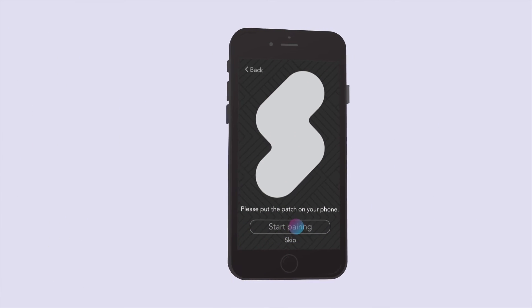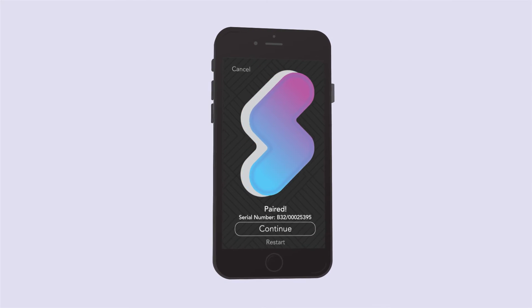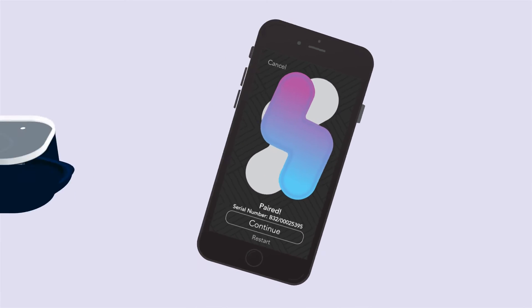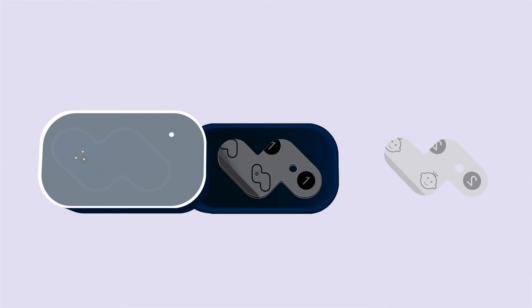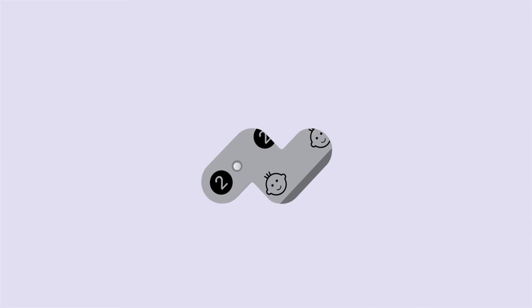Next, follow the on-screen instructions to connect the patch to your phone. Carefully remove side 1 of the adhesive, then align the metal temperature sensor in the back of the patch with the hole on the adhesive. Then carefully peel off side 2 of the adhesive.